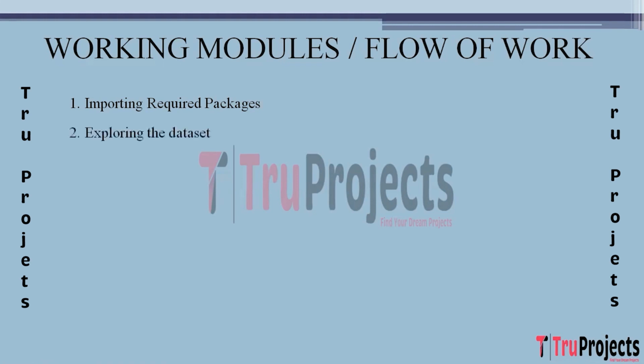The second step is exploring the dataset. In this step, we import MIT-BIH and PTB-DB datasets and focus on understanding ECG images in NumPy format. We explore the structure of the data, inspecting the dimensions and characteristics of the ECG images. This step helps in gaining insights into the data before proceeding to further analysis.